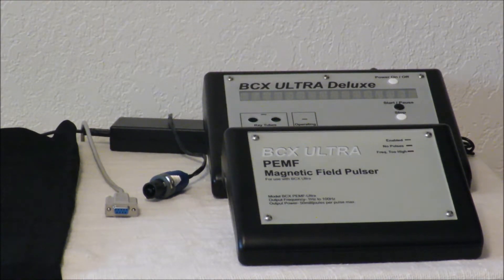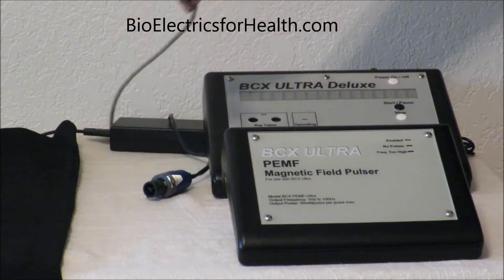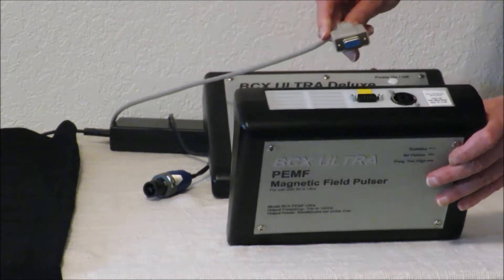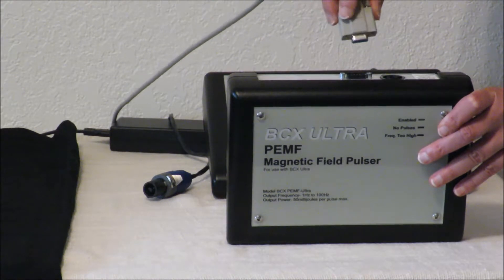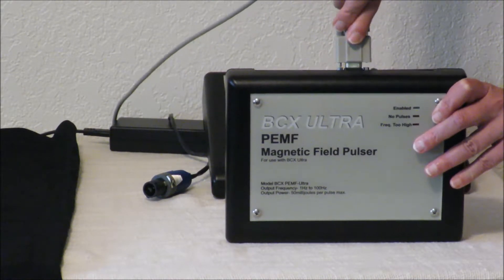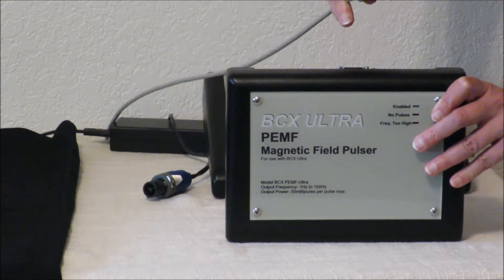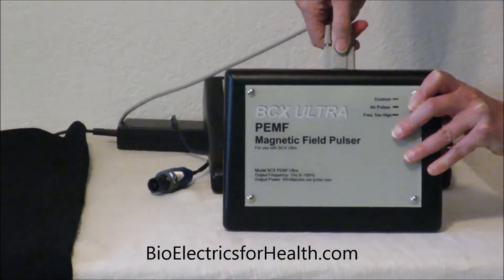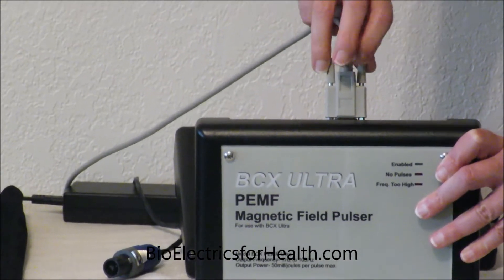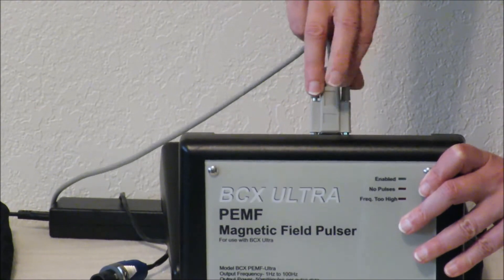Now we are going to hook the two units together — the PEMF Pulsar to the BCX Ultra Deluxe. We're going to start by getting power to the magnetic pulsar unit with the gray cord. That allows the BCX Ultra Deluxe to power the pulsar and give you a greater frequency range. It is a similar plug with screws that tighten down. It'll only go in one way, so that's okay. Tighten each side just a little bit at a time until it is tight.